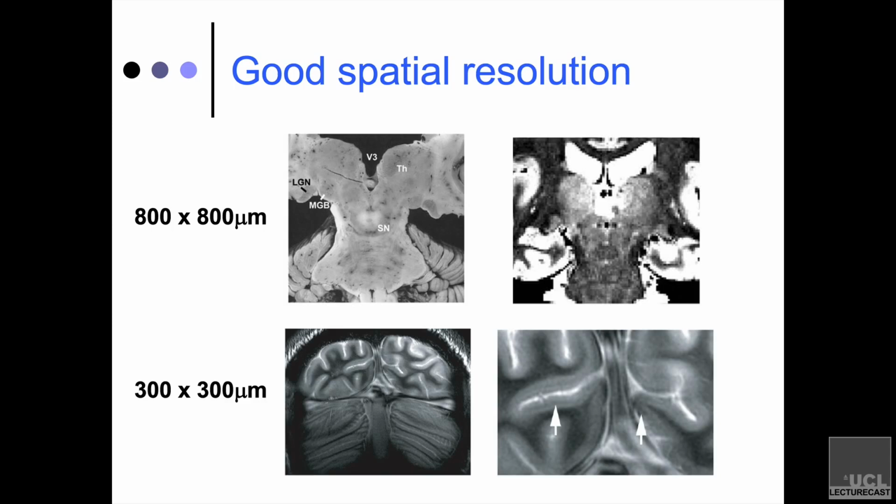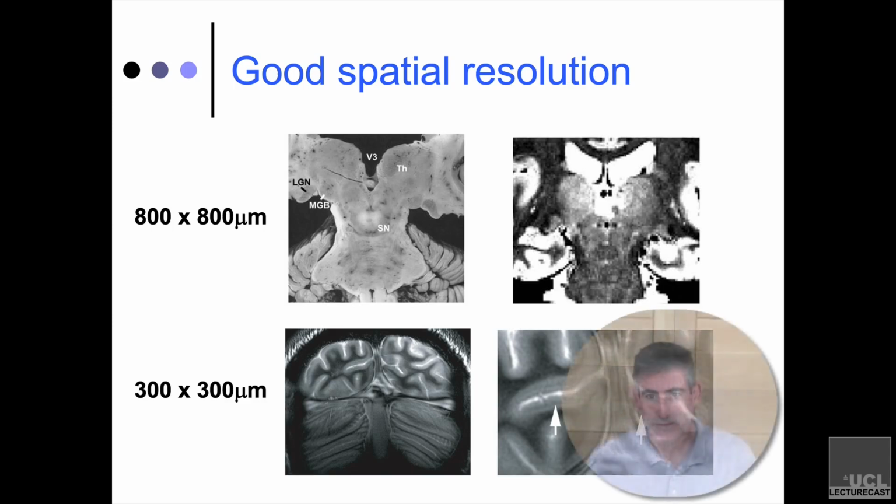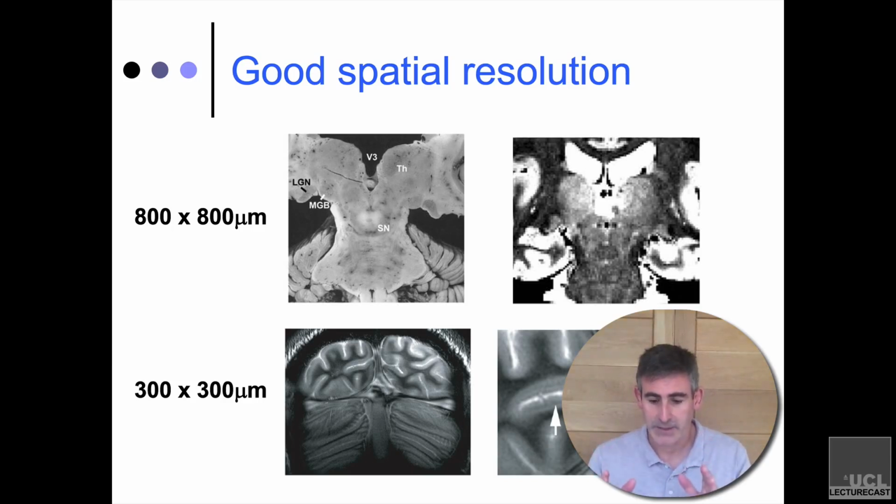which is immensely impressive. Now, spatial resolution in structural imaging like this is essentially limited by how still a person can be. So you can imagine, like any kind of camera, if you're taking a picture of something, as long as it can stay still, you can get a nice clear picture. As soon as it starts bouncing around and moving, then you get blur.